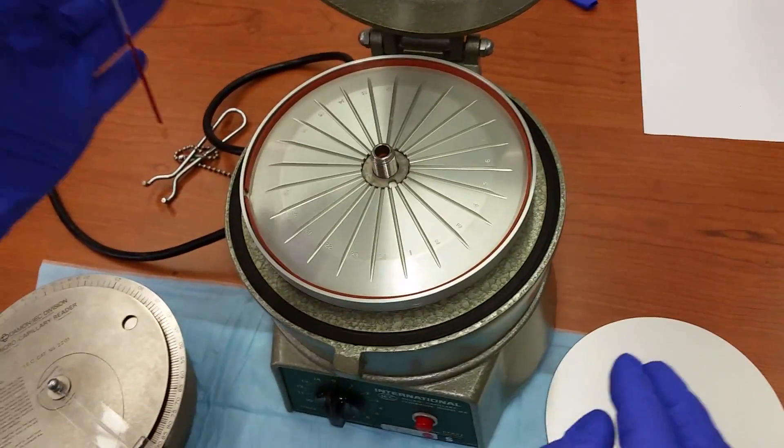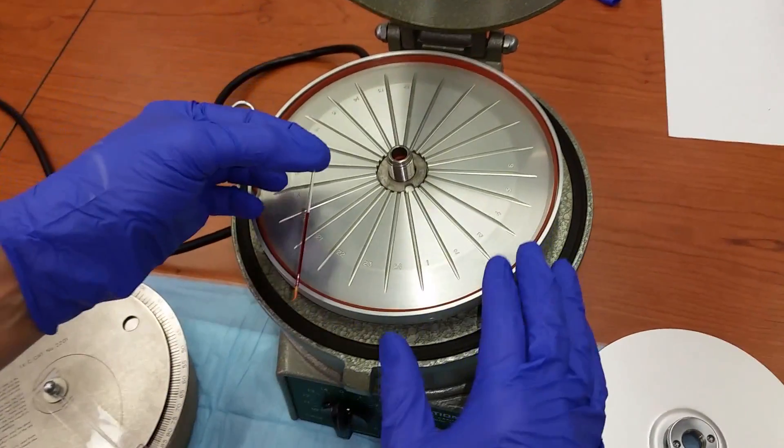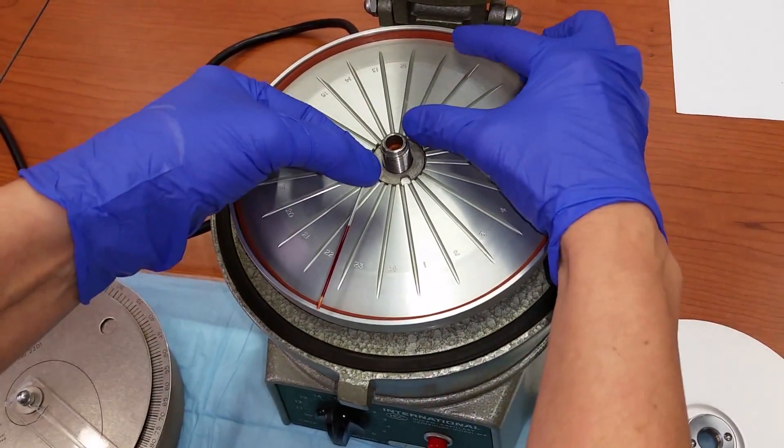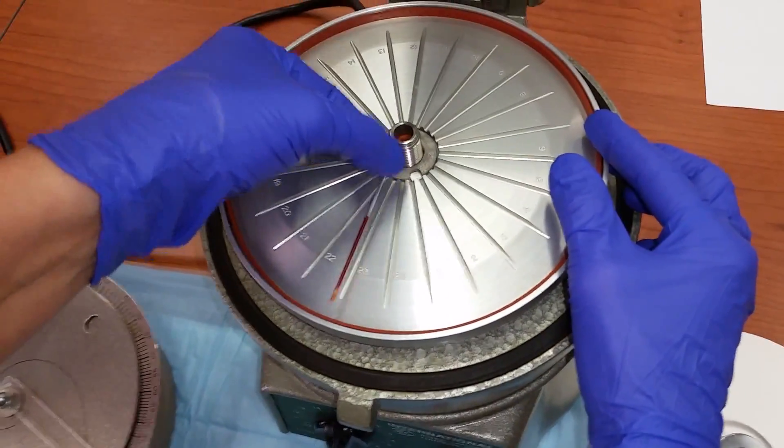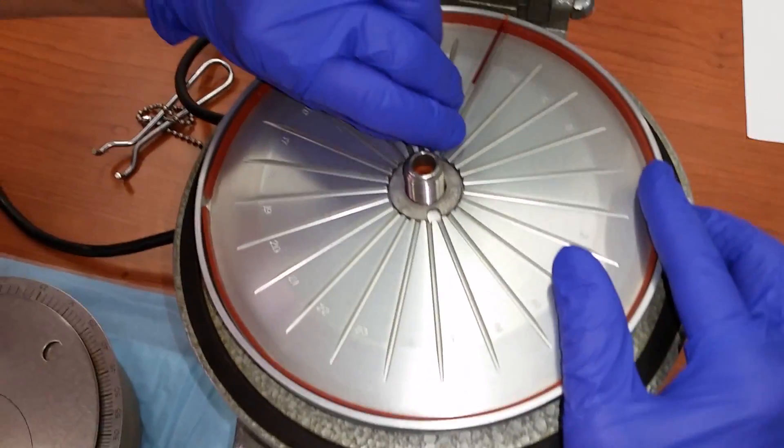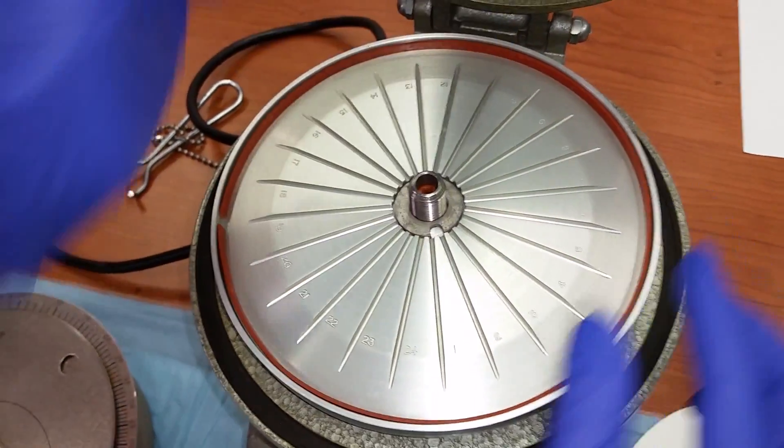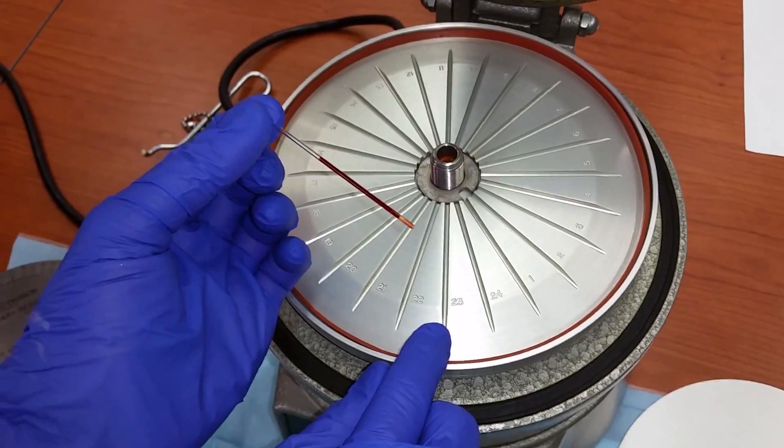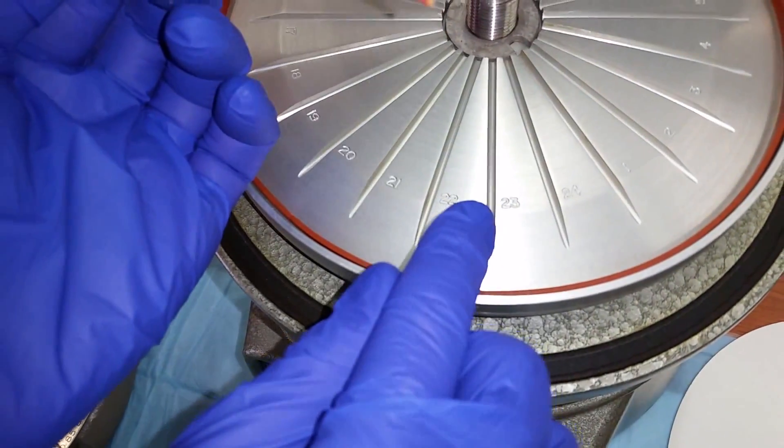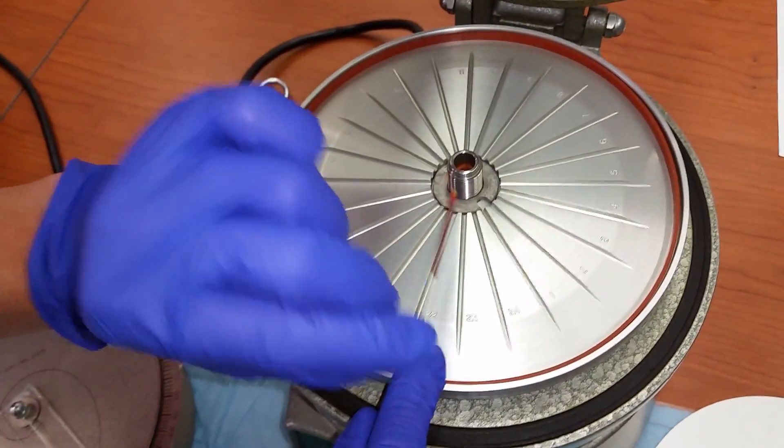Remembering that this is a centrifuge, you need to make sure that the slots are balanced with capillary tubes. If you put a capillary tube in one side, you need to make sure to balance it with a capillary tube on the second side. Because the tubes are obviously too small to write your names on, each of the slots are numbered, so remember the number in which you've put your tube.